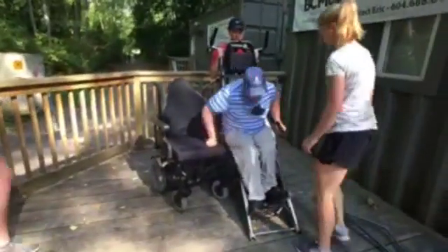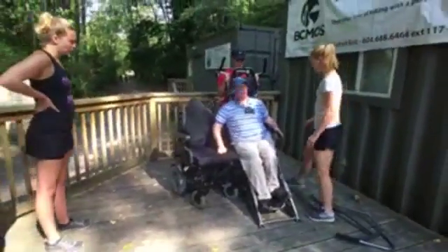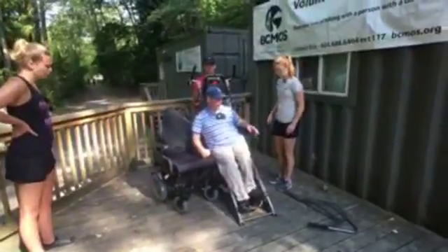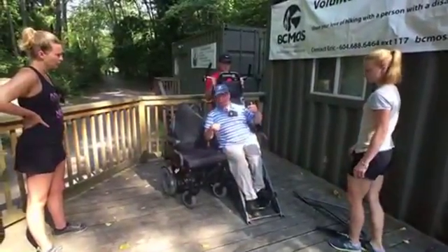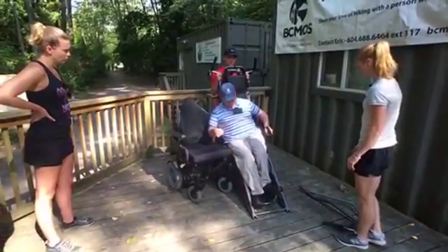So this chair is pretty comfortable. As you can see, it's pretty similar to a wheelchair seat cushion. If you were going to do a hike and you thought that your seat cushion was similar to the Trailrider cushion, it just all Velcros on, so you can switch as needed.